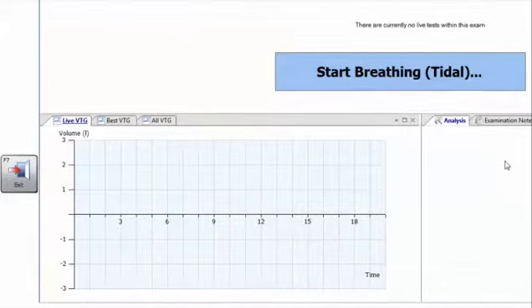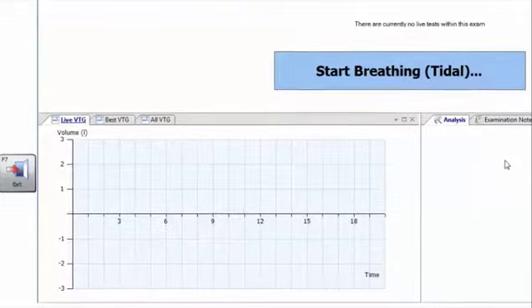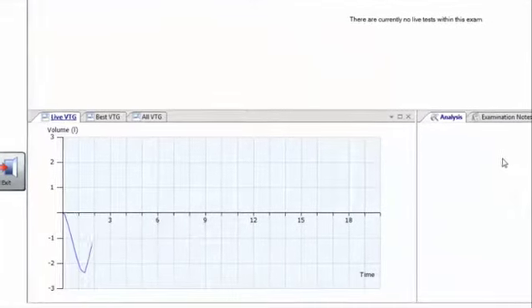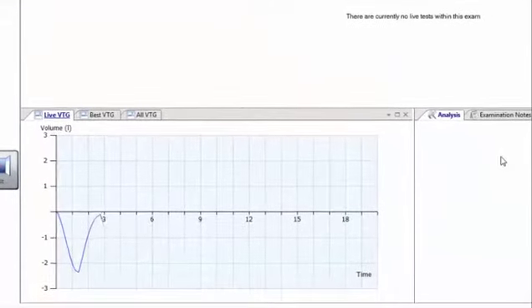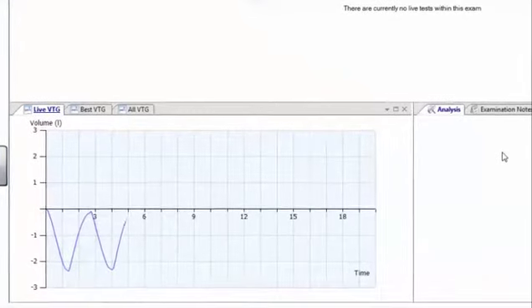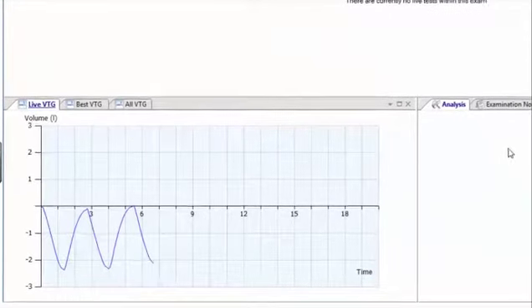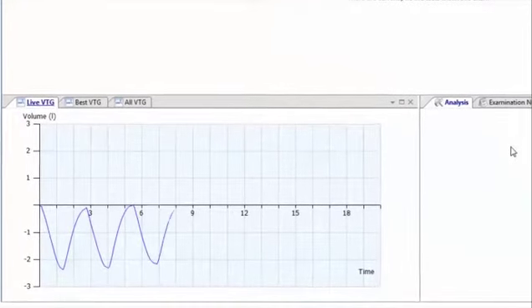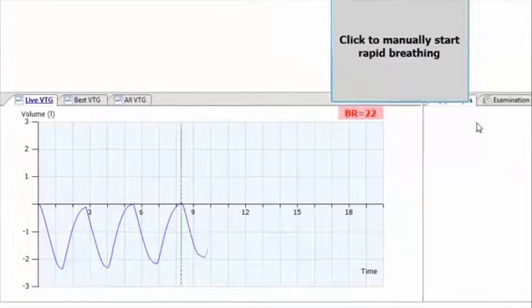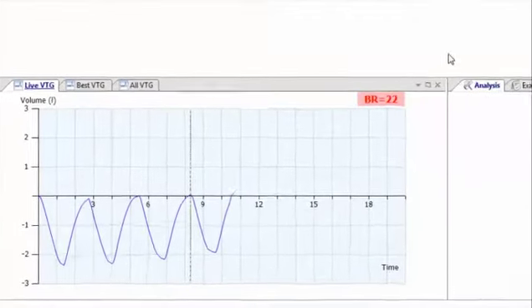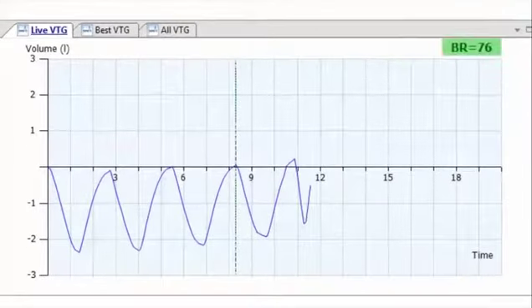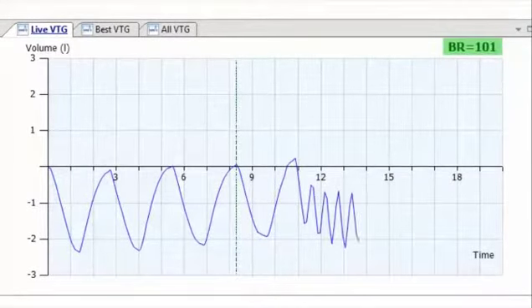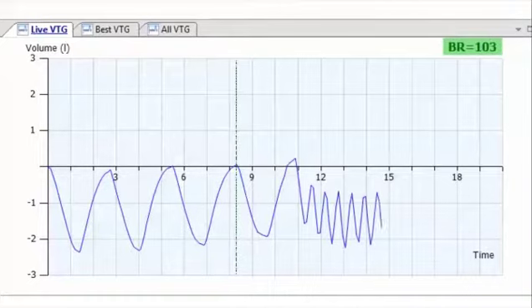You should then click on the button to start detecting MVV breathing and immediately instruct the patient to start heavy rapid tidal breathing. The display will show the breathing cycle line in green to indicate the completion of the 12 second test.